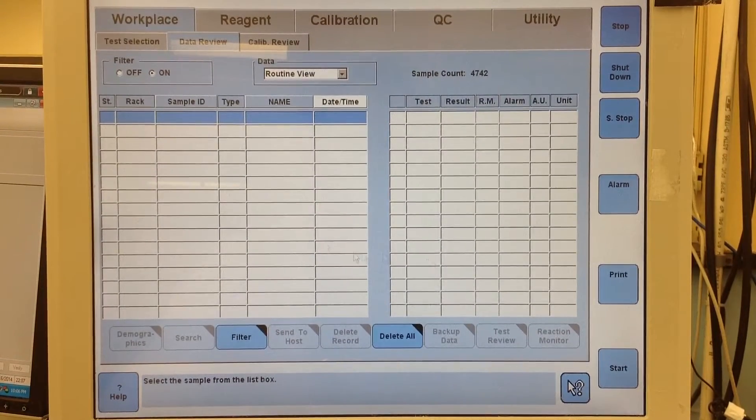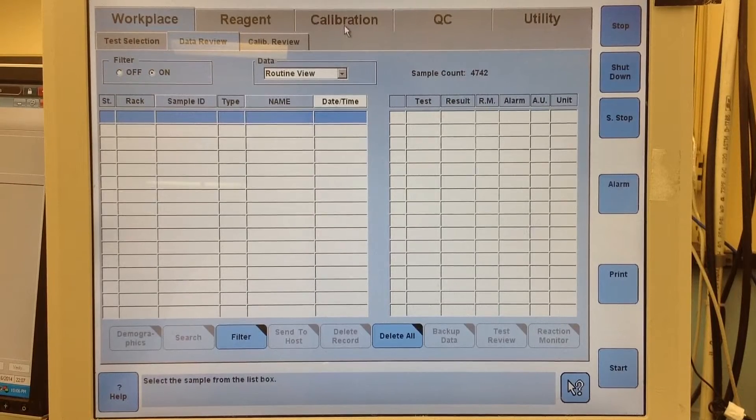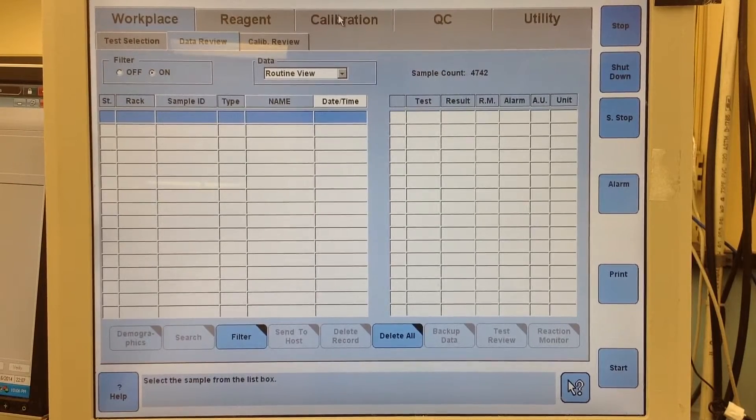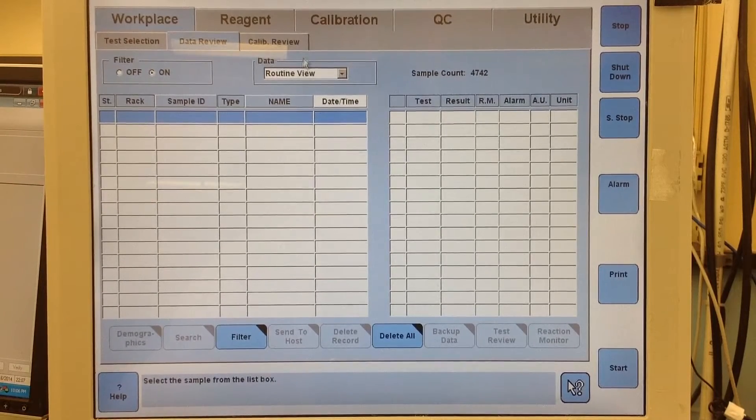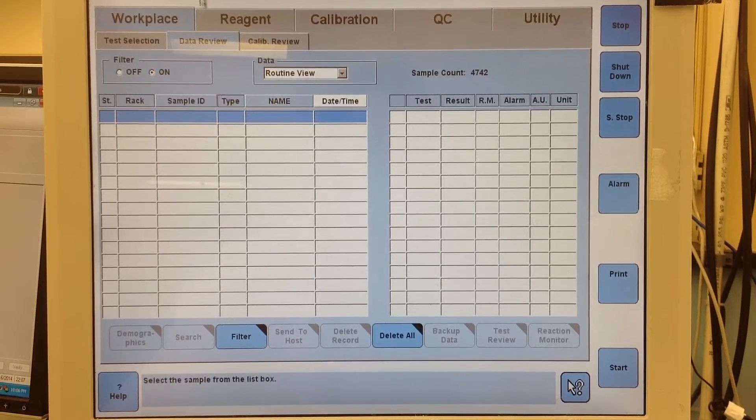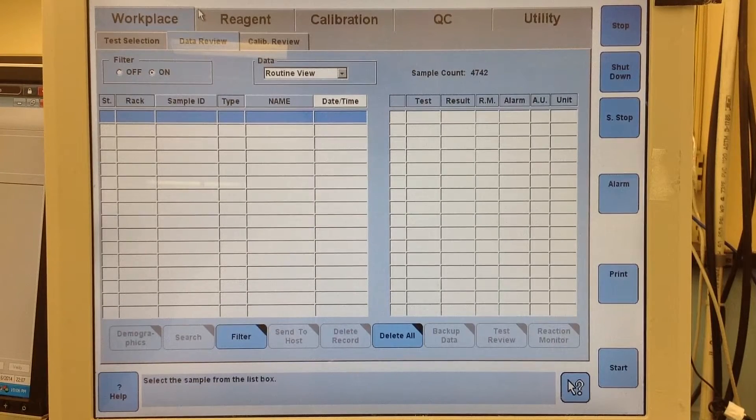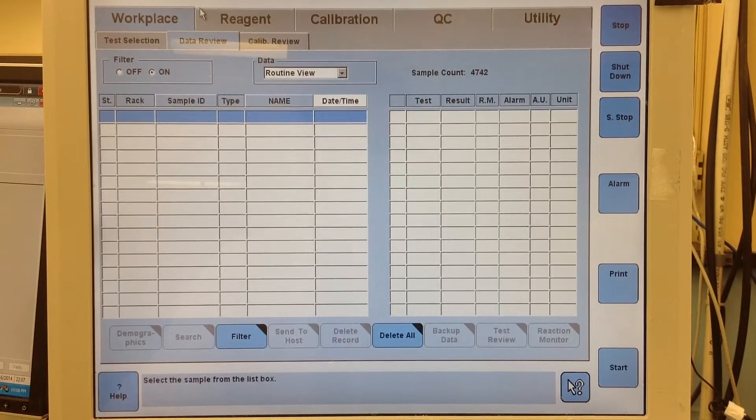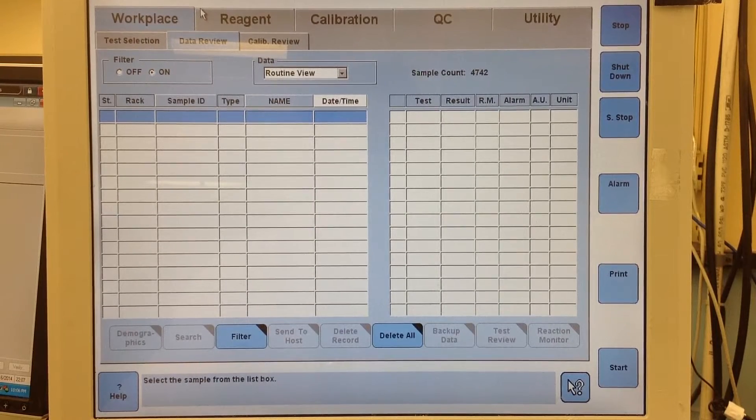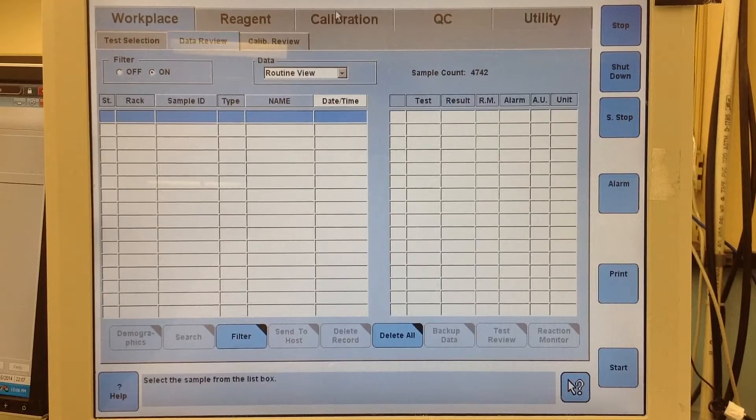I'm going to show you how to upload a new lot of calibrator. First thing is you have to be in standby to download any new lots, whether it be reagent or calibrators.